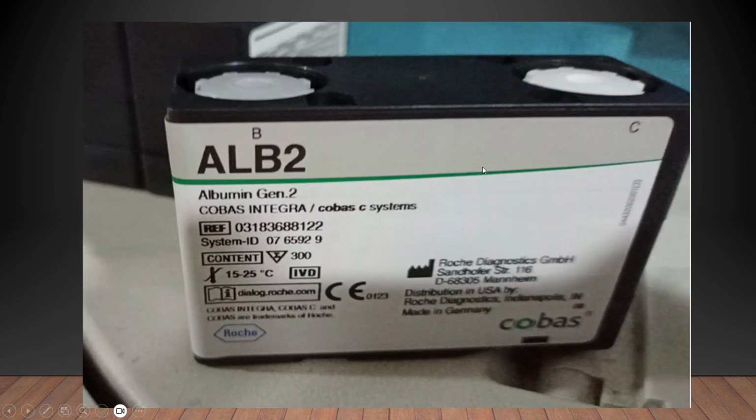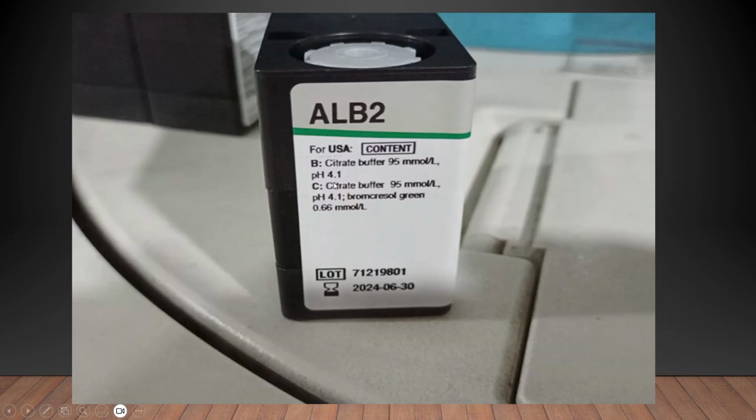So how to see the lot number? See, if you go to this area, it is written here what the lot number is, like 712198. Now the last 2 digits you can always ignore. Even with all the COBAS systems, the last 2 digits you can always ignore, because they will be like 00, 01, 02, 03, 04, 05, 06. Up to 06 I have seen.